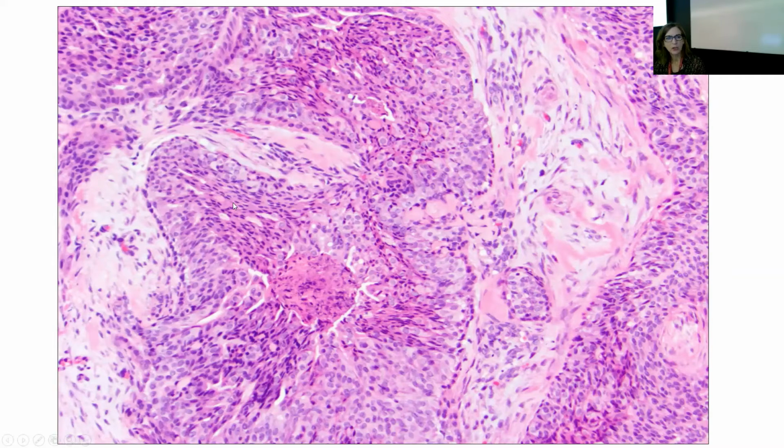But as you start to look at the epithelial proliferation, I think there's a lot of heterogeneity here. There are some small nuclei, some larger nuclei. The spaces are slit-like, and it doesn't really look like there's any polarization, which of course is not so helpful in intermediate grade DCIS, but something to think about. And I think it does try to polarize, even though it doesn't do it very effectively.